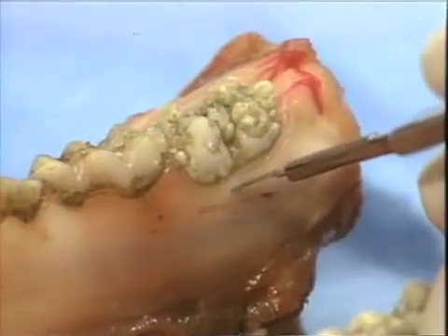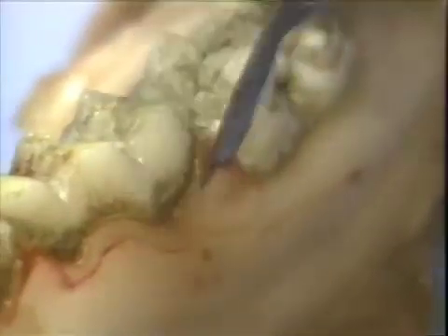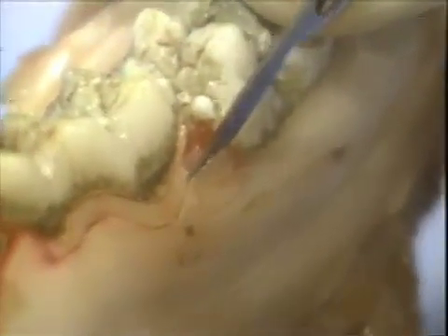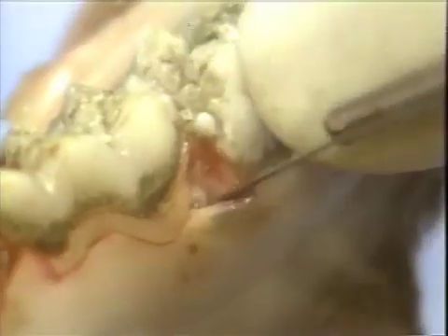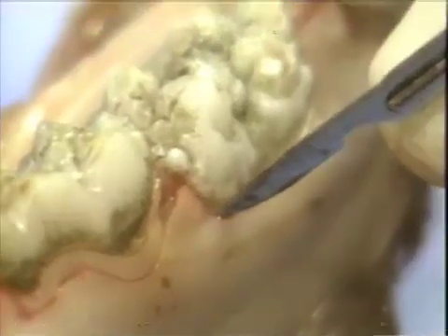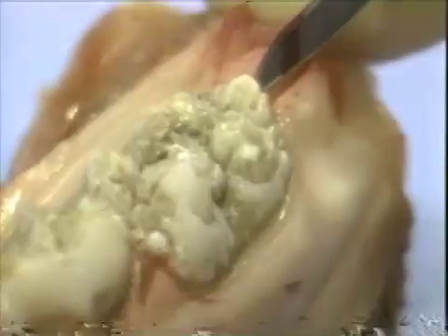Incisions are continued along the lingual and buccal surfaces of the terminal tooth. We would like to demonstrate how to thin interproximal papillary tissue during initial flap reflection. While the papilla is at its base, the papilla can be gently elevated using light tension, and the blade angle changed to undermine the papilla. The incision is carried to the crest and blended with the neighboring incision.